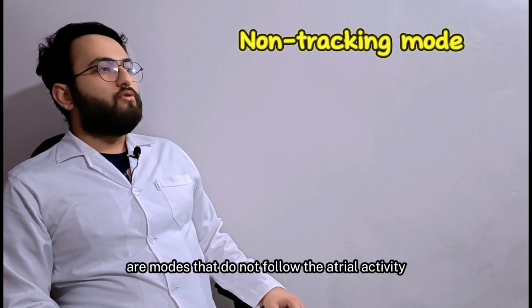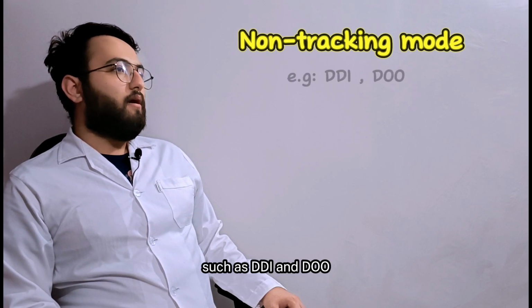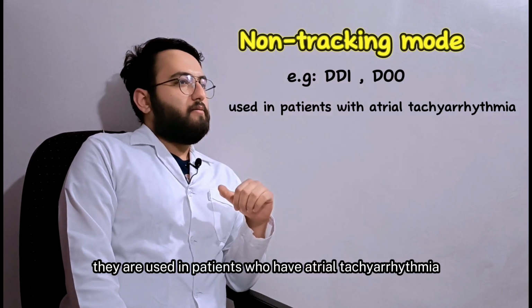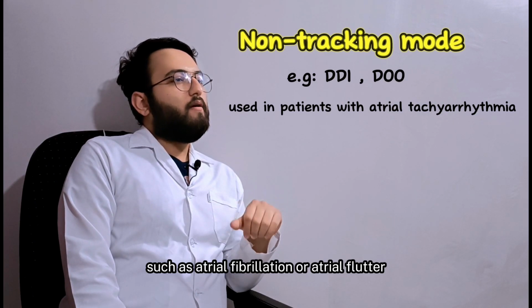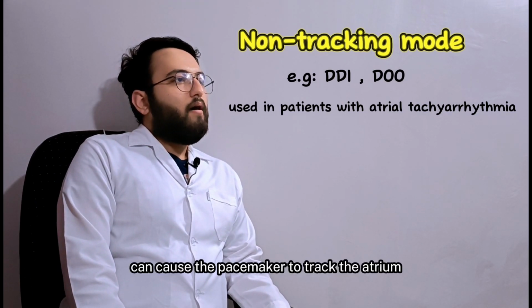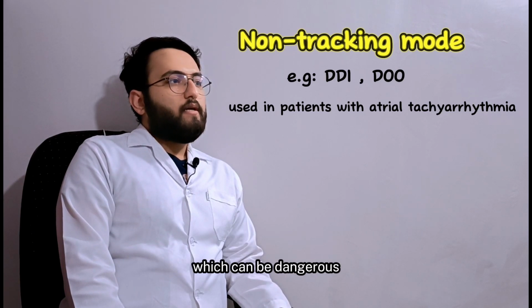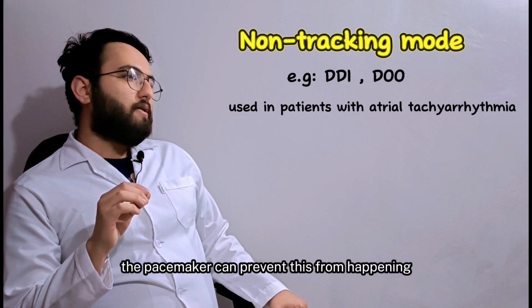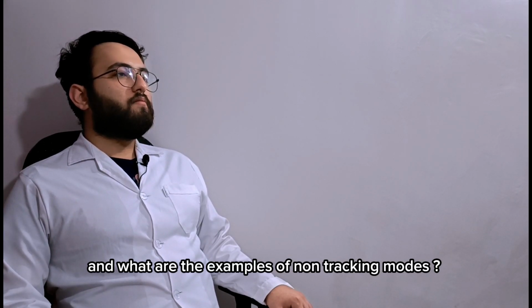Non-tracking modes are modes that do not follow the atrial activity and do not adjust the ventricular pacing accordingly, such as DDI and DOO. They are used in patients who have atrial tachyarrhythmias, which are fast and irregular heart rhythms in the atrium, such as atrial fibrillation or atrial flutter. These rhythms can cause the pacemaker to track the atrium and pace the ventricle at a high rate, which can be dangerous and uncomfortable for the patient. By using non-tracking modes, the pacemaker can prevent this from happening and pace the ventricle at a safe and comfortable rate. And what are the examples of non-tracking modes?